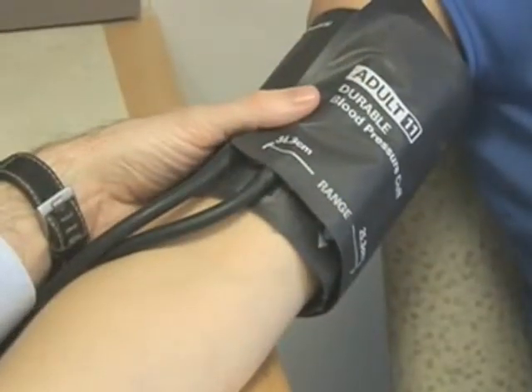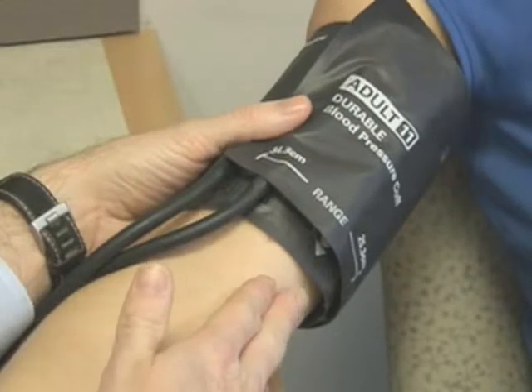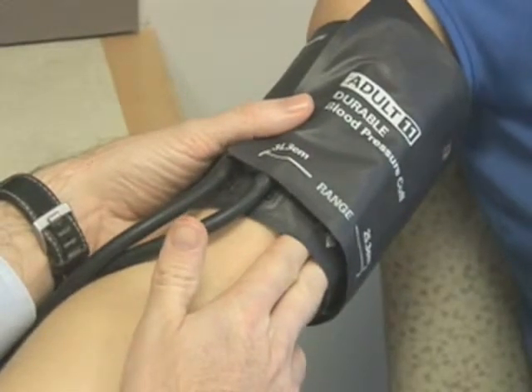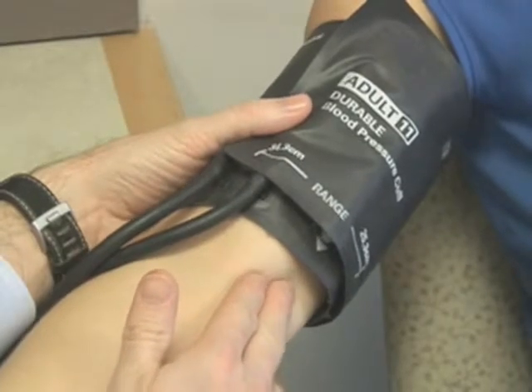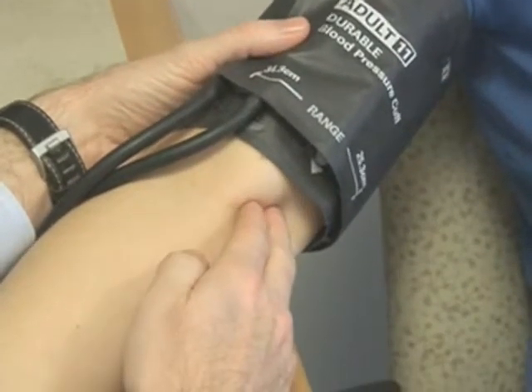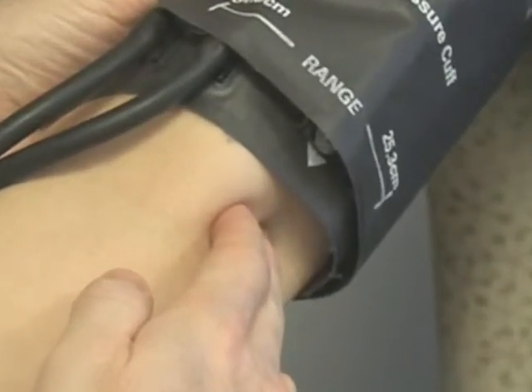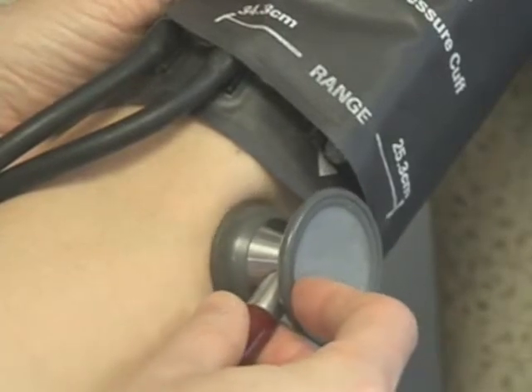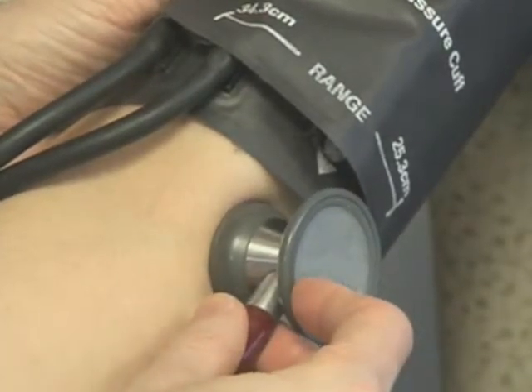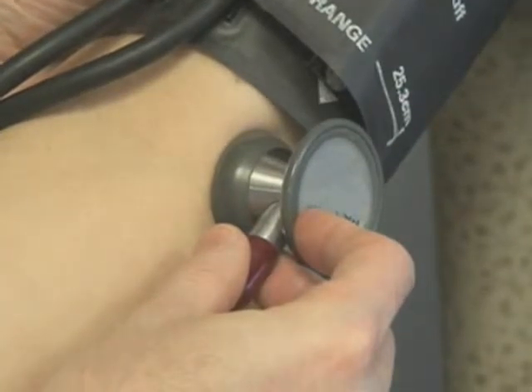The cuff should be applied 2 centimeters above the crease of the elbow. It should fit snugly, but still allow 2 finger widths under the cuff. Next, find the brachial artery, which is palpable approximately 4 to 5 centimeters from the medial epicondyle on the anterior surface of the elbow. Place the stethoscope lightly against the skin over the brachial artery. There should be appropriate pressure to ensure good sound transmission. The stethoscope should not be in contact with clothing or with the cuff.